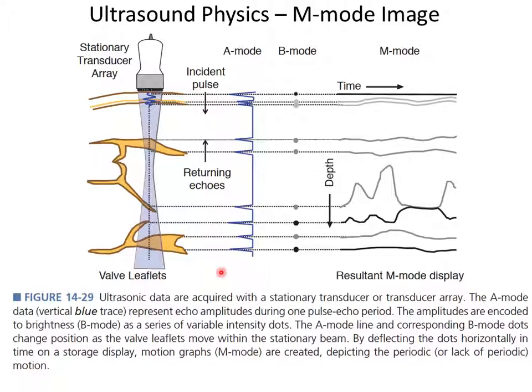So I could take this process and just sweep it, right? Sweep it back and forth like a windshield wiper, just going bang, bang, bang. And I can do that such that I can make images at 30 frames a second or whatever, because I'm sampling at such a high frequency, right? So this B mode thing here, I don't have to get it in the same orientation. I can actually move my transducer sensitivity back and forth and make a 2D picture.